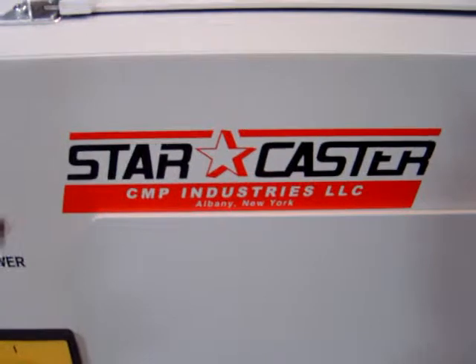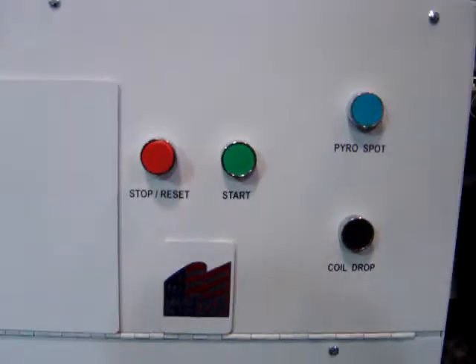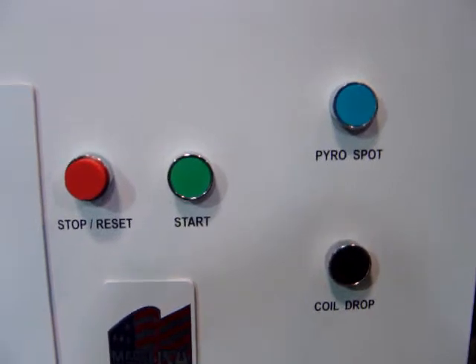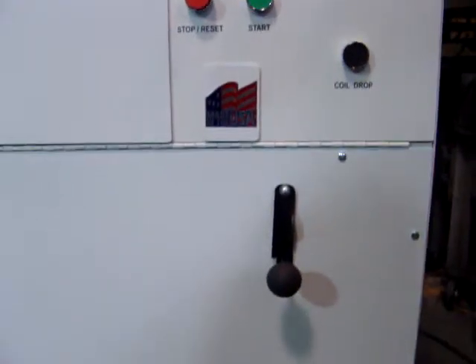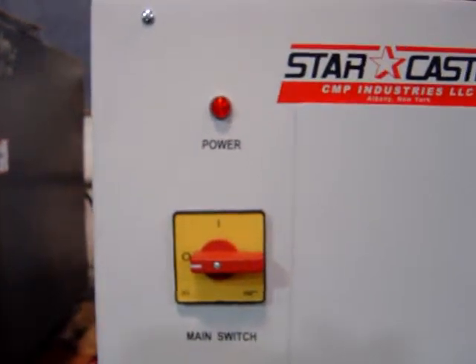CMP StarCaster, second generation. Controls on the new system: the reset, the stop, the start, the coil drop, and the pyrometer spot remain on the front panel along with the coil lift lever and the main power switch.